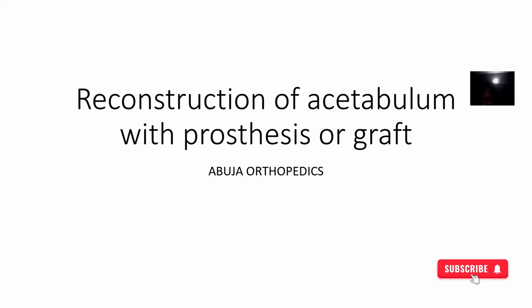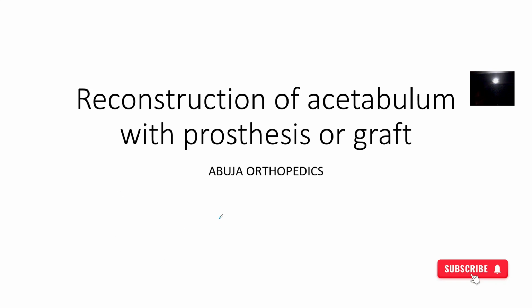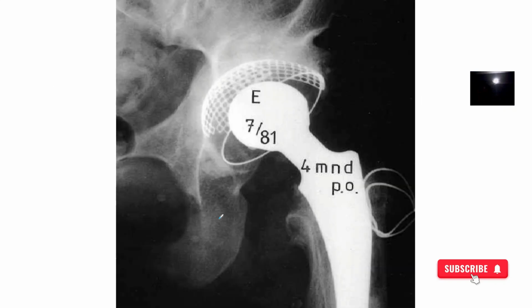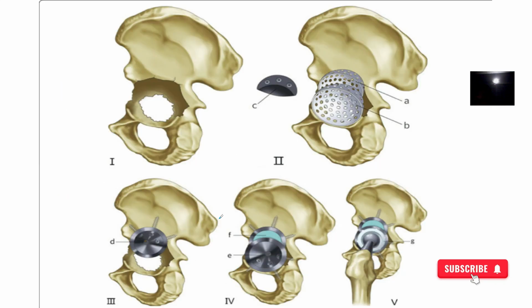So we're looking at the reconstruction of what? Acetabulum with prosthesis or graft. So it's just another way of repairing any issues at the hip joint. Okay, so I'm trying to reconstruct, okay, with prosthesis.